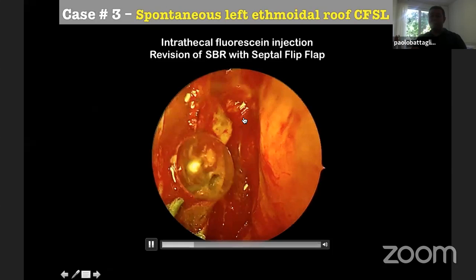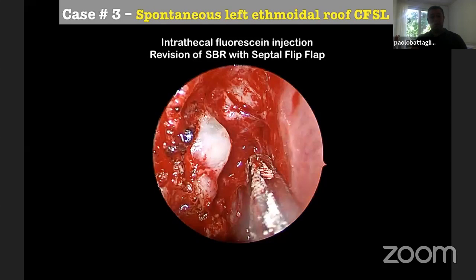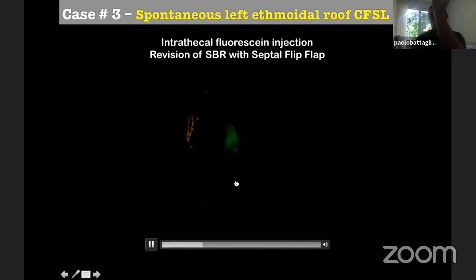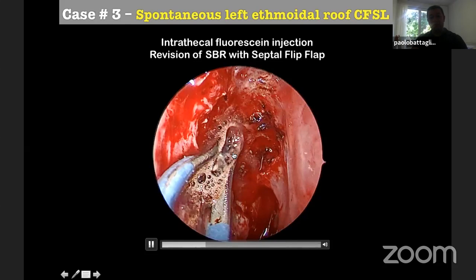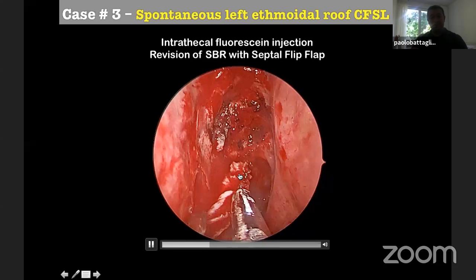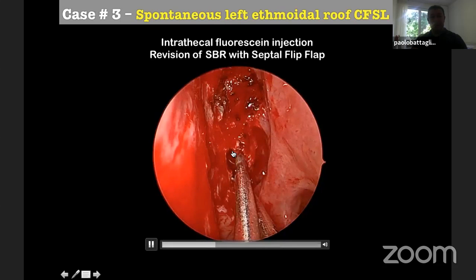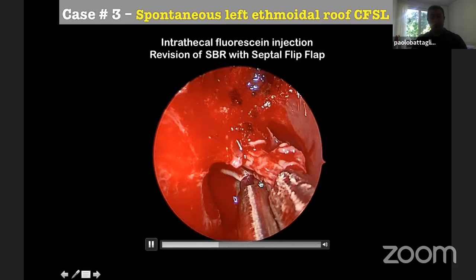You see, with the fluorescein, you can very well understand where the defect is localized. So again, we coagulate the herniating brain over here, but it's not enough. We want to arrive at the level where the brain comes out. So we need to arrive till the bone. So coagulating again, removing all the scars. Here, removing the posterior part of the remaining Haddad flap over here, and we remove it with the pedicle. And then looking for our landmarks, the sphenoid was closed over here with the Haddad.